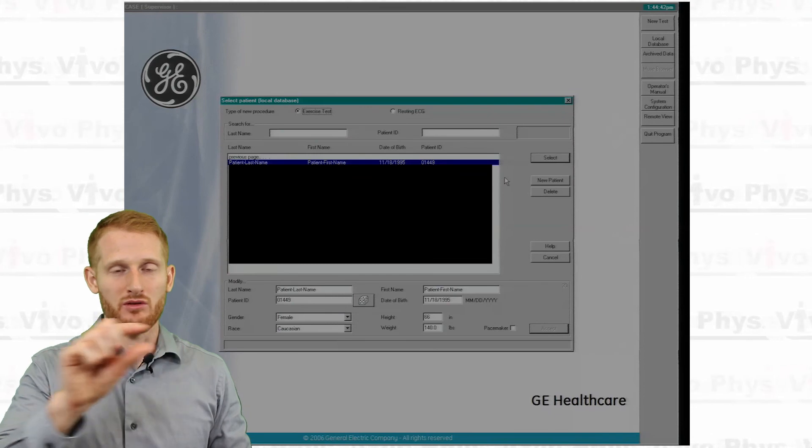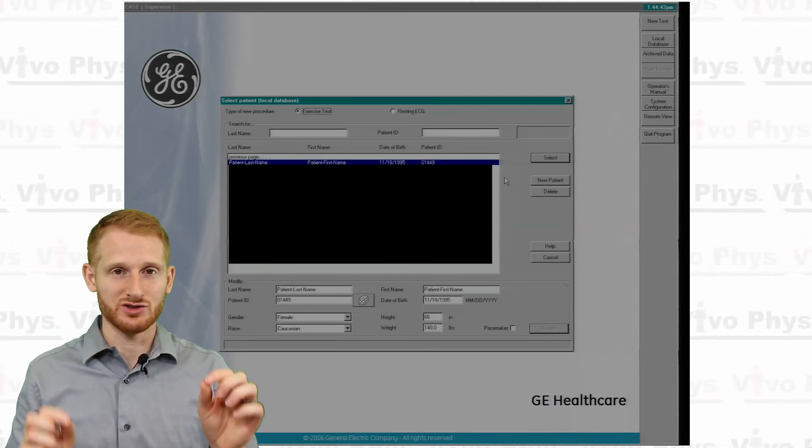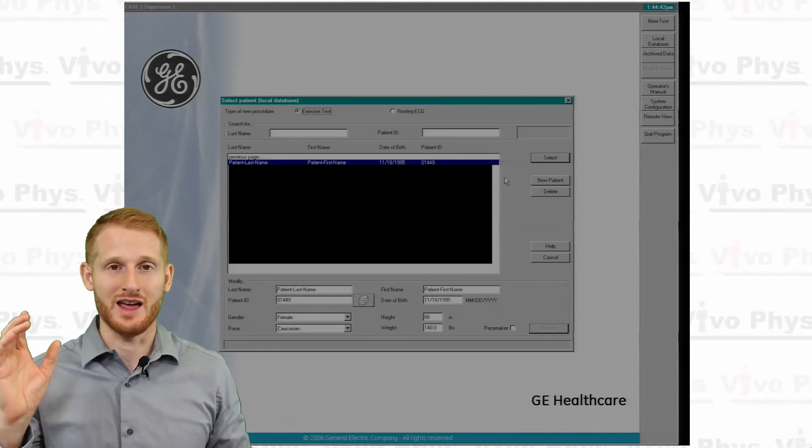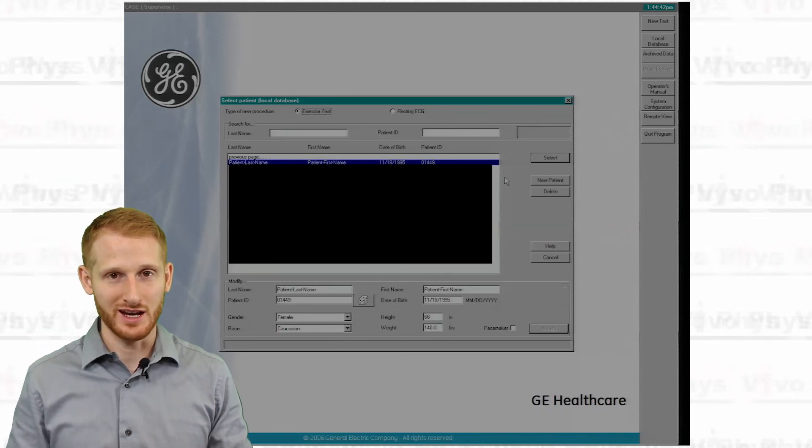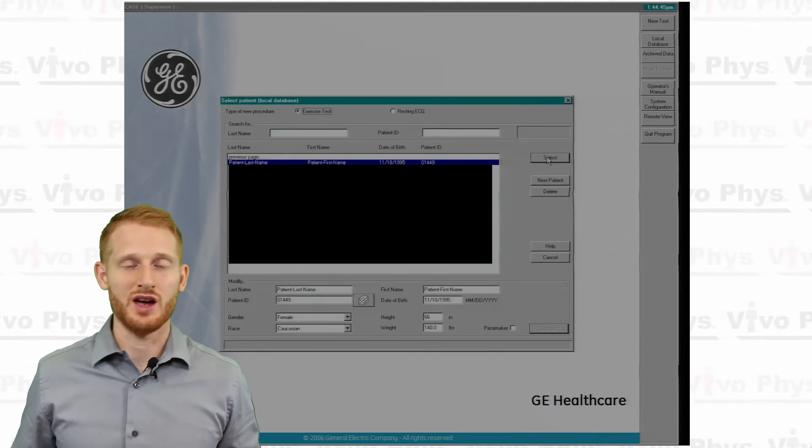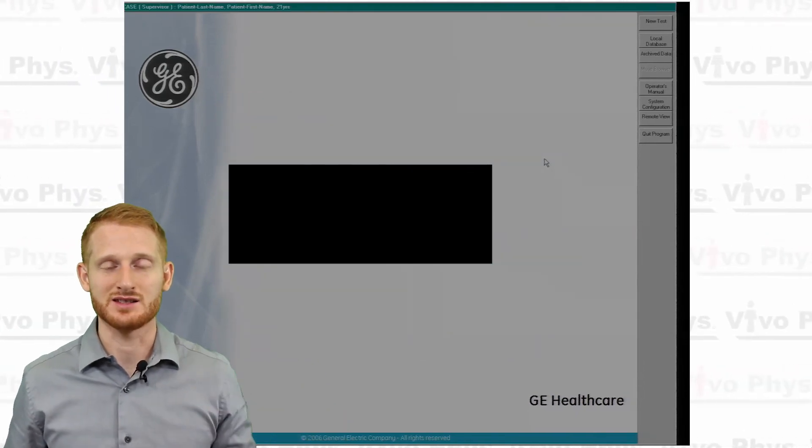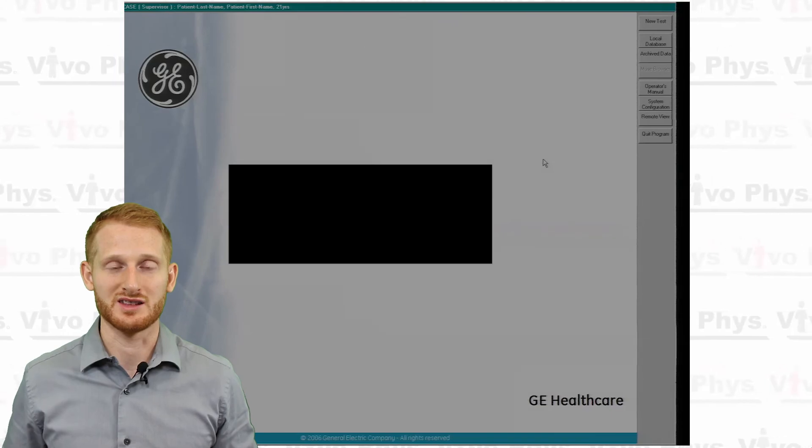Make sure that you put in the rest of the information, and then go ahead and hit accept. Then go to the top of this box, and there's check boxes for either a resting test or an exercise test. Make sure you check the appropriate type of test that you plan on doing. Once you have the person selected and the type of test selected, then you just go ahead and click select.